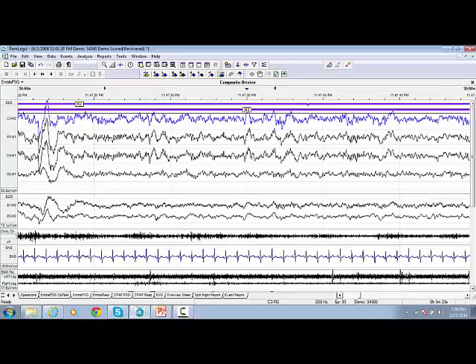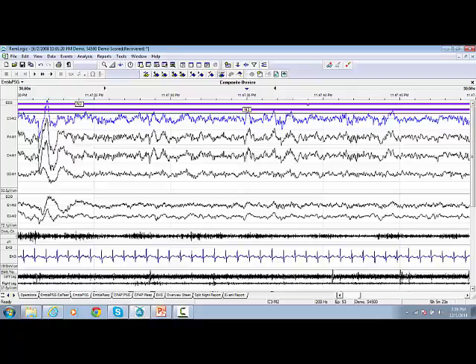In this video, I'm going to demonstrate how to use the hypnogram. The hypnogram view displays an overview of the sleep stages for the recording.